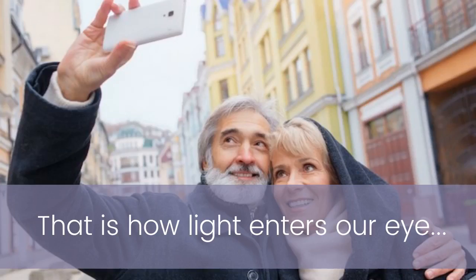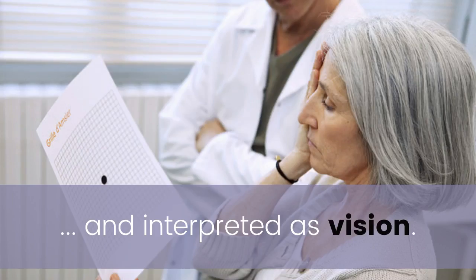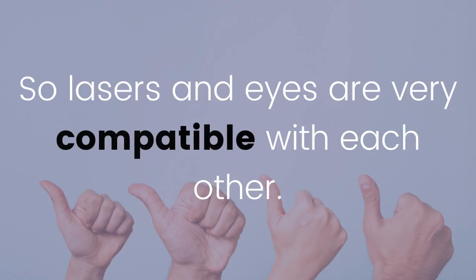That is how light enters our eye and gets converted to electrical signals that are sent to our brain and interpreted as vision. Laser energy is taken up by the melanin present in the retinal nourishing layer. So lasers and eyes are very compatible with each other.